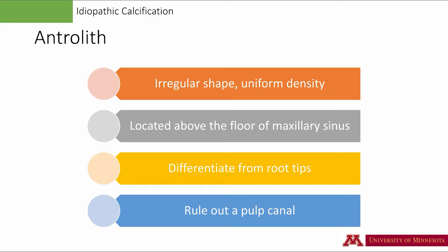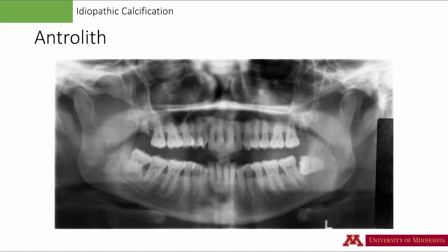An antrolith is a calcification inside the sinus or antrum. These calcifications have an irregular shape and uniform density. Because these are inside the sinuses, we look for radiopacities above the floor of the maxillary sinuses. If there is a missing tooth, we have to rule out a displaced root fragment inside the sinus — root tips are usually conical, so try to identify the presence of a pulp canal. This well-defined circular radiopacity superimposed over the left maxillary sinus does not have the shape of a root tip, and all the roots are present, including the root of the carious maxillary left third molar. The best way to confirm location is to obtain another radiograph at a 90-degree view or cross-sectional imaging such as CBCT.